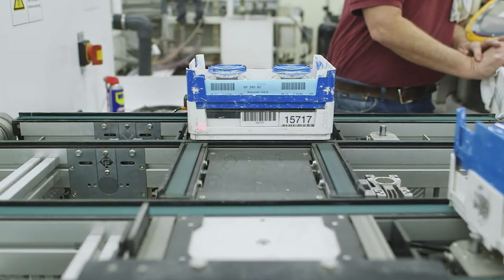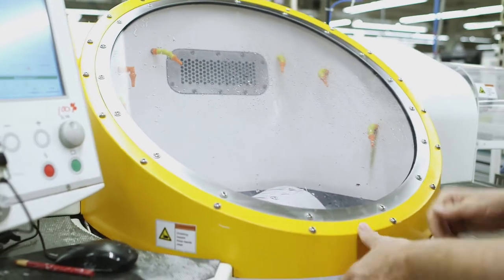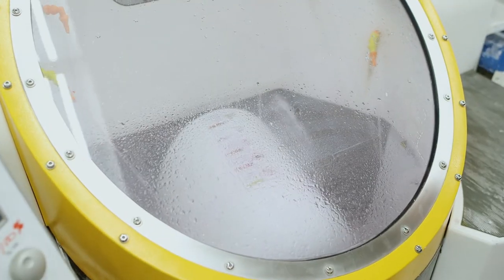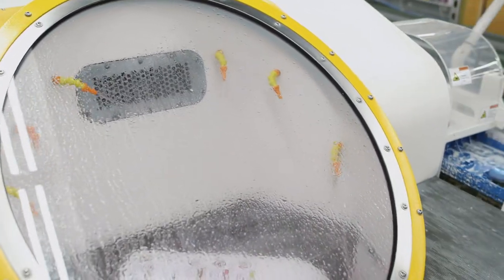Now the lens is carved, or generated. The generator cuts the optical curves for your prescription. In early 2015, Midland Optical added an additional generator, allowing us to increase our production capacity by an amazing 600 jobs per day.